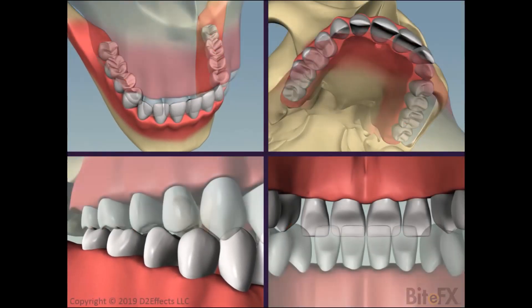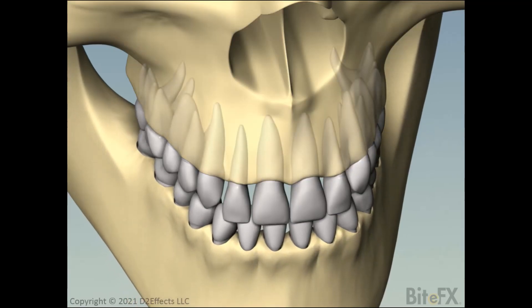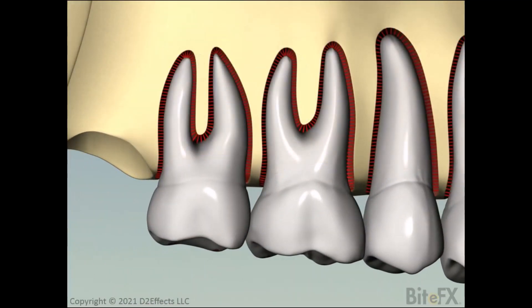Although our teeth feel like they are firmly embedded in our upper and lower jaw bones, that's not quite true. Our teeth are attached to the bone by thousands of tiny ligaments called periodontal ligaments, often abbreviated to PDL. We show the PDLs in this animation in red, and we greatly exaggerate their size so you can understand the principle of how they work. When our teeth close together, the PDLs provide a slight cushion to that impact.